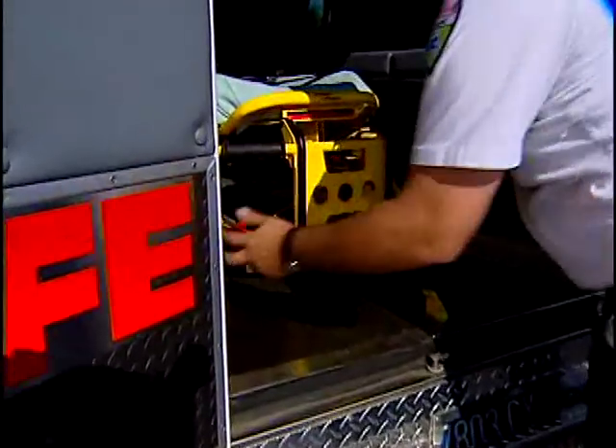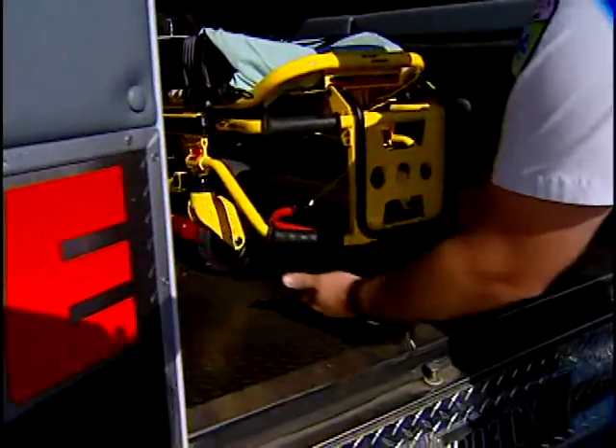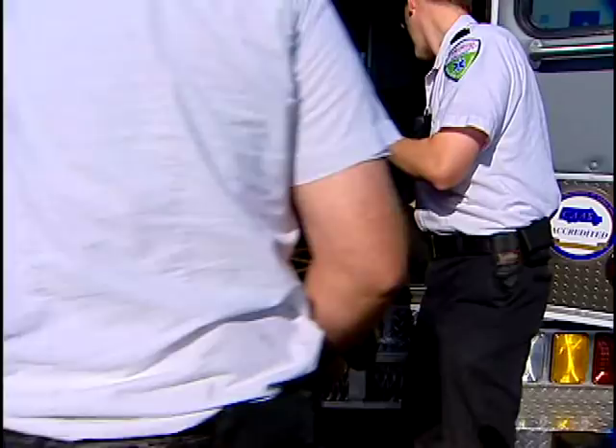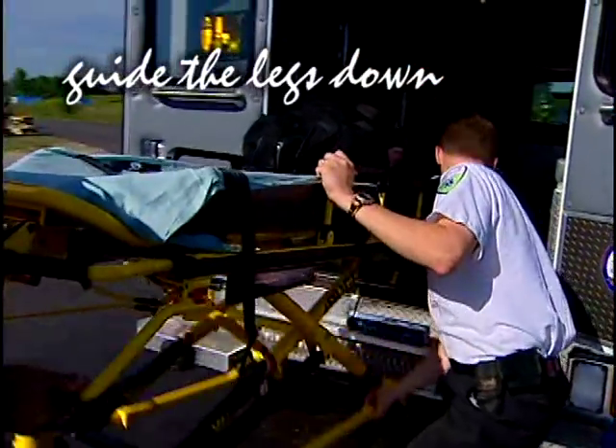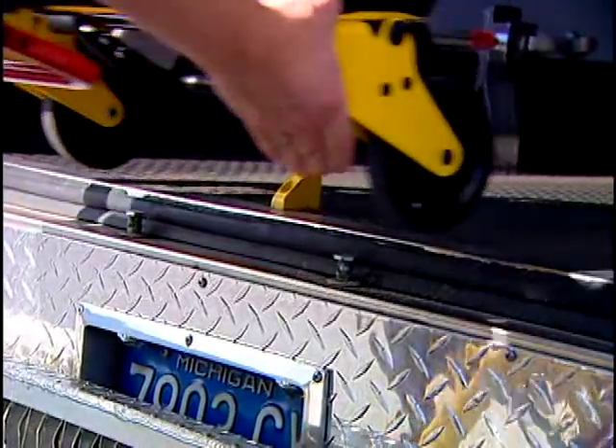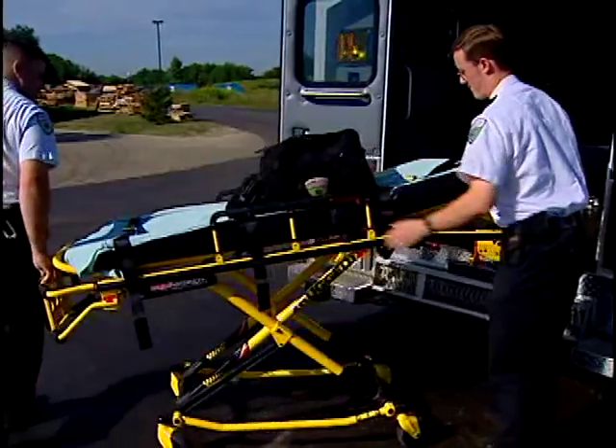As you unload the cot, release it from the fastener and move it out of the ambulance using the lower grips whenever possible — that helps reduce back strain. When the safety hook stops your motion, the second operator guides the legs down to be sure that they're fully extended and locked. Release the safety bar and roll the cot away from the ambulance.